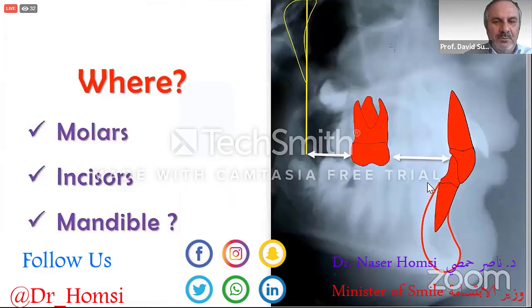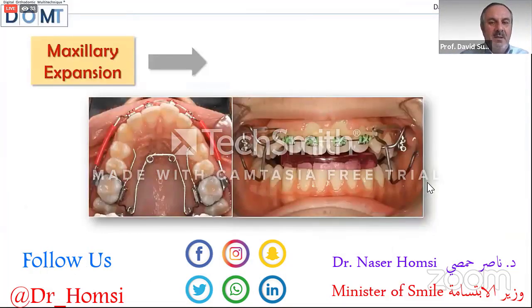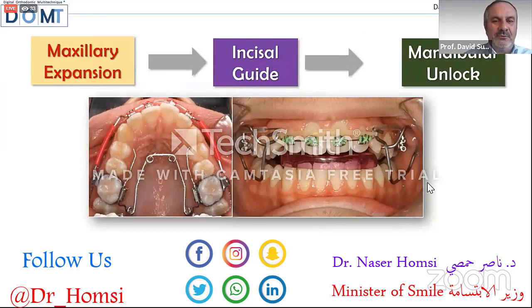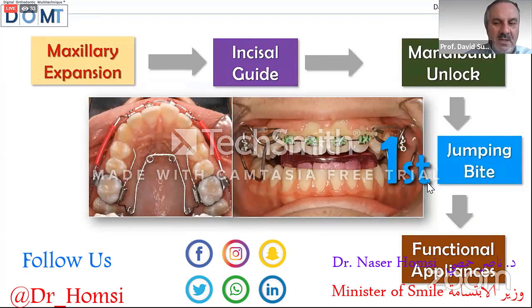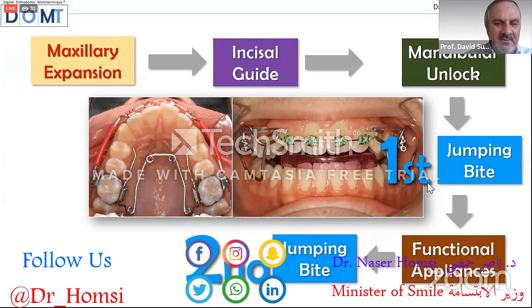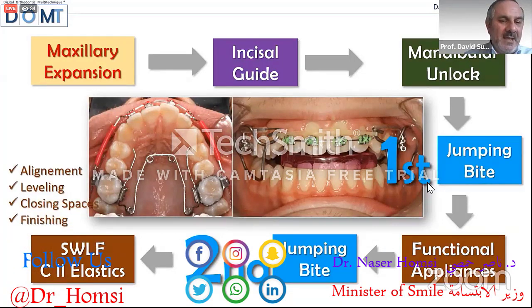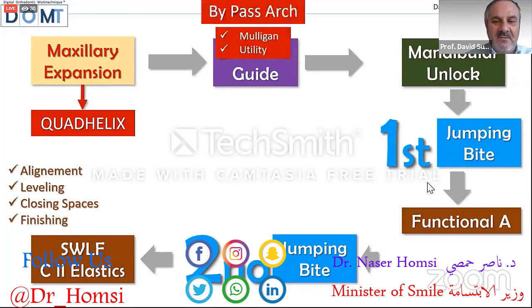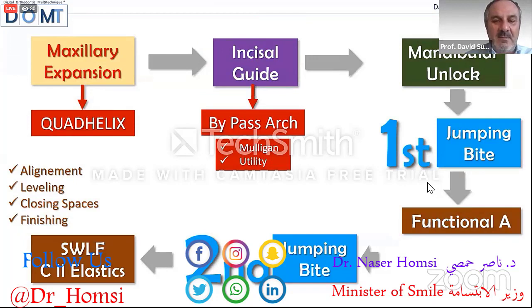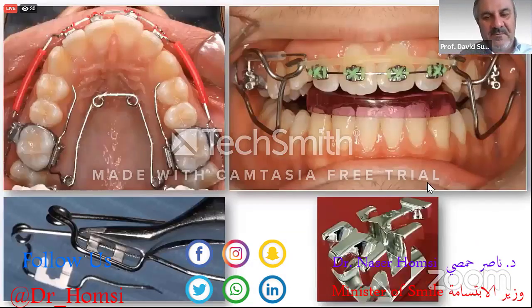Now we have to analyze the cephalometric analysis: maxillary expansion, control of the incisor guide, mandibular unlock, first jumping the bite, second the use of functional appliance, second jumping the bite, and finishing with the technique of alignment, leveling, closing space, and finishing with the straight wire, low friction, with the Synergy bracket. We use Quad Helix for the maxillary expansion, bypass arch wires for the incisal guide, and for the functional appliances, Frenkel, Bimler, or another type of Frenkel.